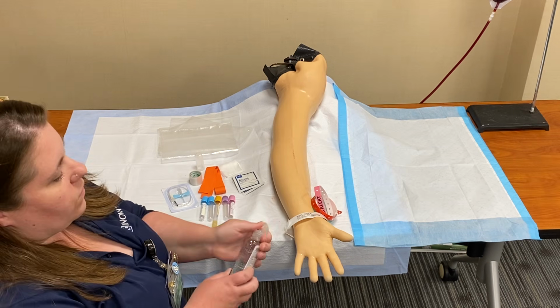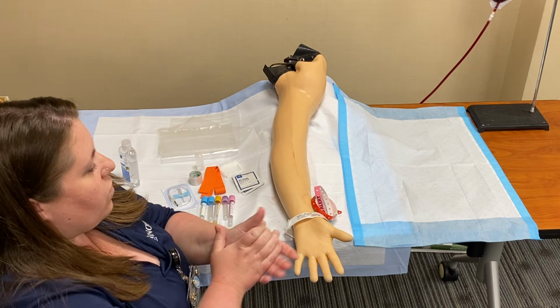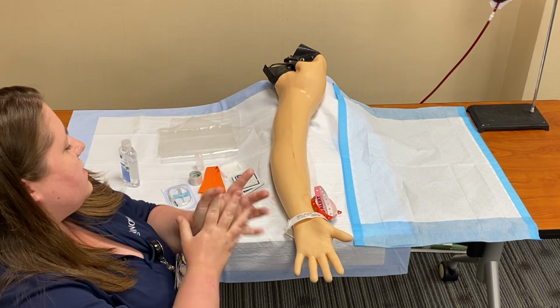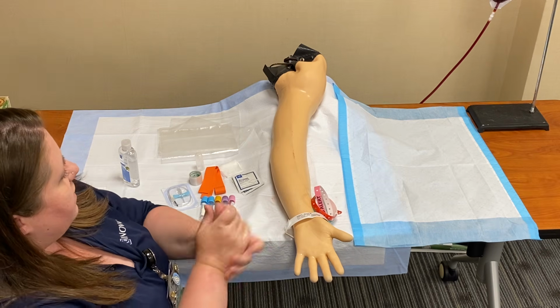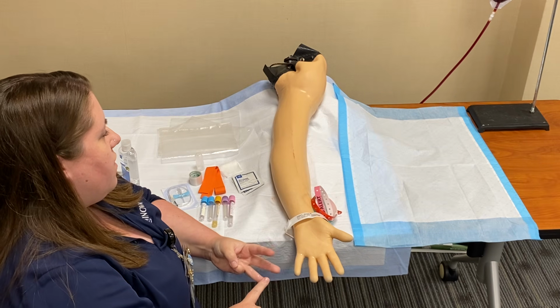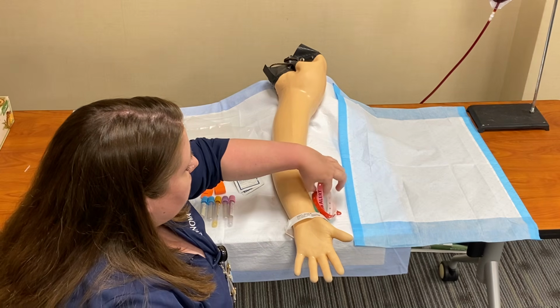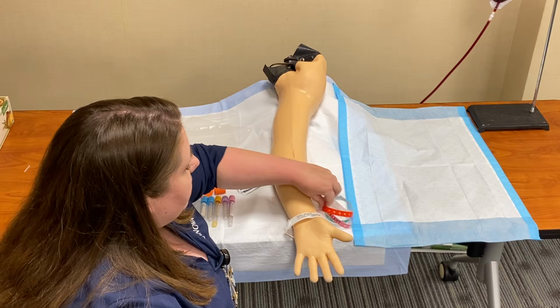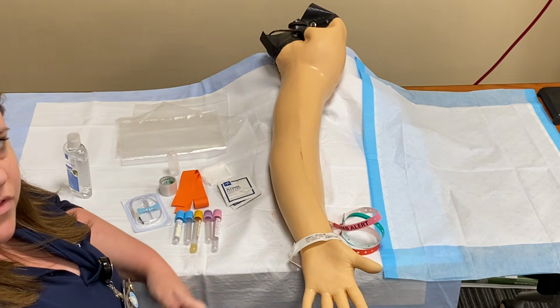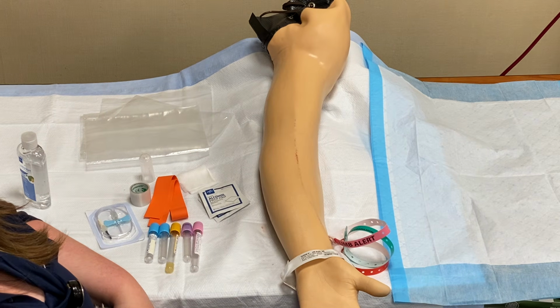So I'm going to come back over and wash my hands since I touched the computer. And I have a few more questions for her. So, Miss Gray, I'm going to ask if you have any restrictions. These would be a stroke, a fistula, a mastectomy, or a PICC line. I'm also going to look to see if she has any bracelets on her wrist. And I see she does have a limb alert. She tells me she had a mastectomy on the right side, so I'm going to know not to use the right side and to go to the left side.